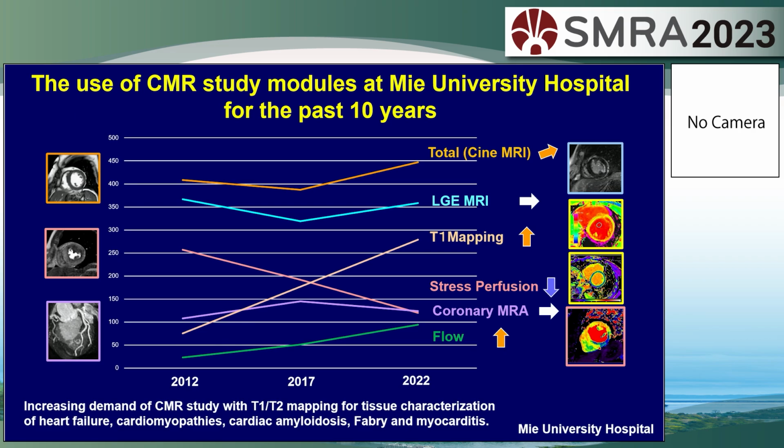This is because we do stress perfusion CT, and the total number of CMR has also changed. We would also like to emphasize that coronary MRA continues to be used in our hospital.